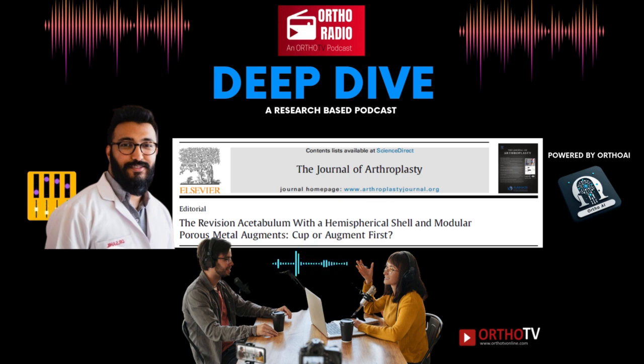I got it. So once you have that base, whether it's created with augment first or augment second, you need to secure it properly. And that's where cement comes in. Cement is key. It holds everything together, especially the augment to the cup. So it creates one solid unit. Exactly, and it helps prevent metal debris, which is really important for the long-term health of the implant. Absolutely. It's like the unsung hero of revision hip surgery.